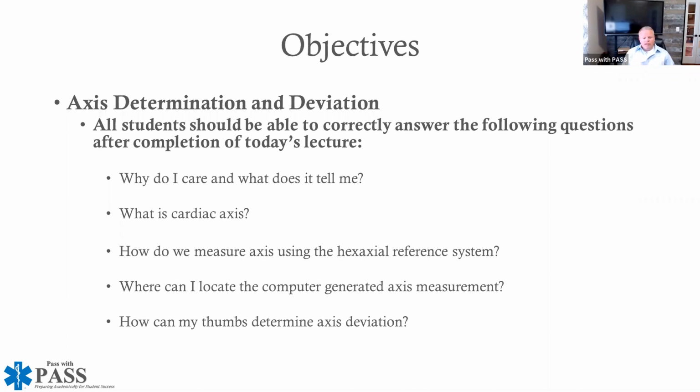How do we measure the axis using the hexaxial reference system? And that's kind of a big word. It really is pretty simple once we start looking at that. So again, everybody in the room, regardless of certification level, you're going to be on board today and not be completely lost. You don't have to be a paramedic in order to do this or figure it out or anything like that.